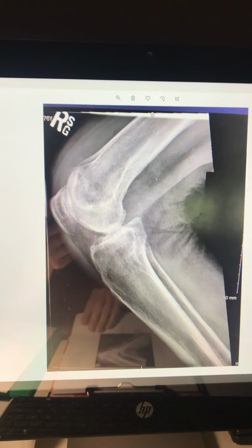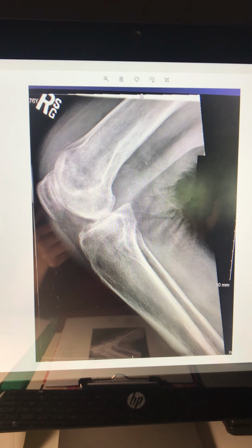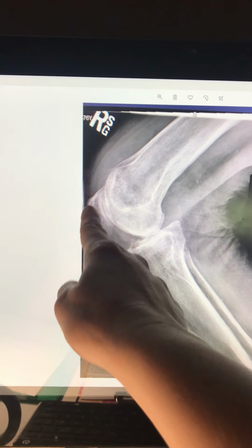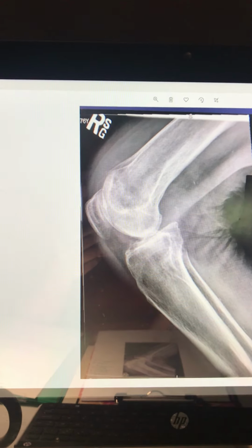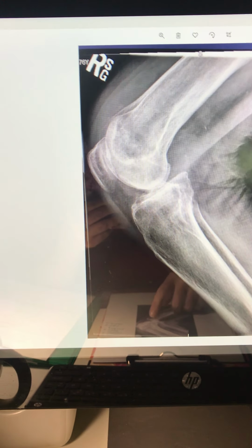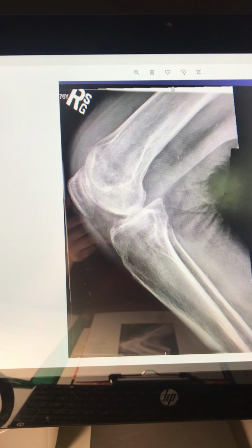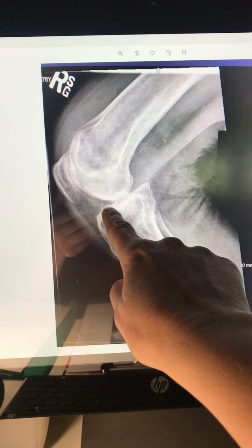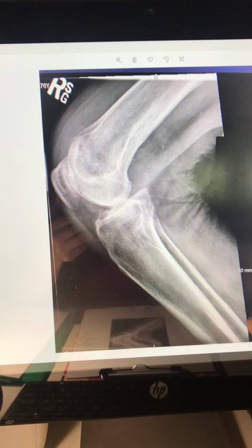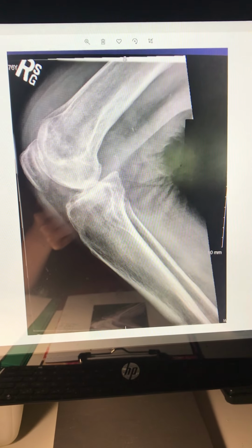What we see on this, and again on all of these, the technique possibly could have been reduced because she does have a lot of bone loss, and all these darkening areas could have been reduced. So we have the femur right here, the femoral condyles there, superimposed. The tibial plateau is right here, and the tibia and the fibula is back there. All right, thank you.